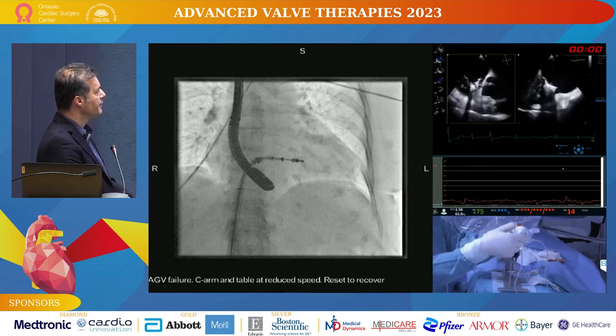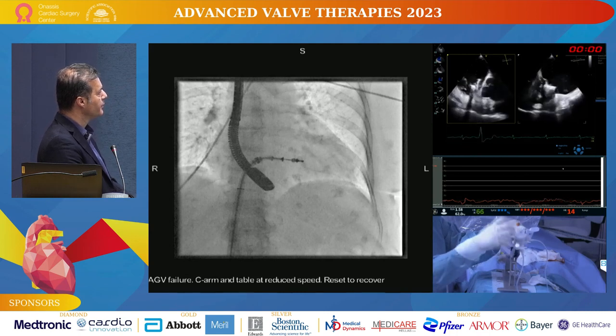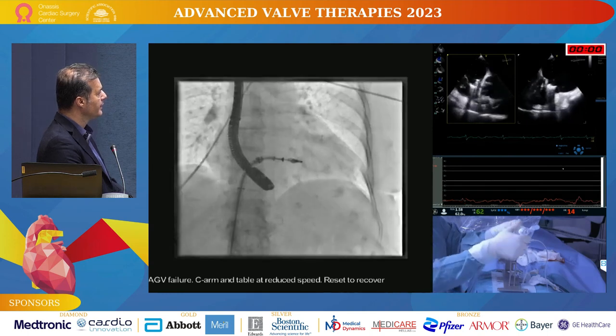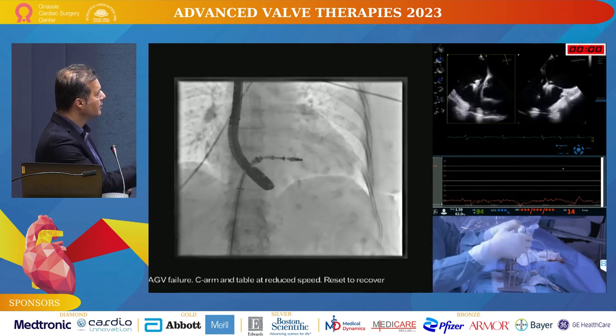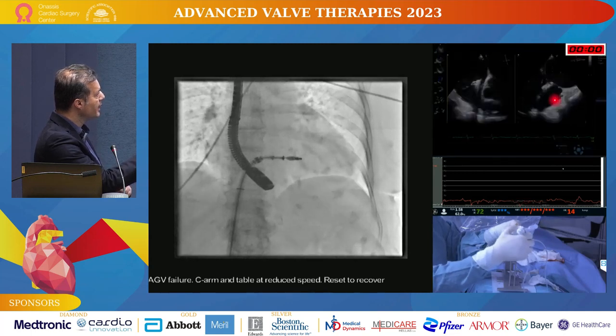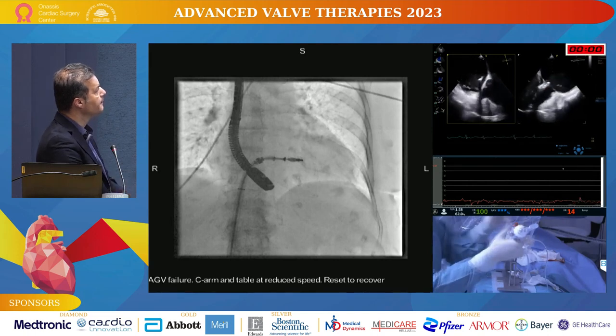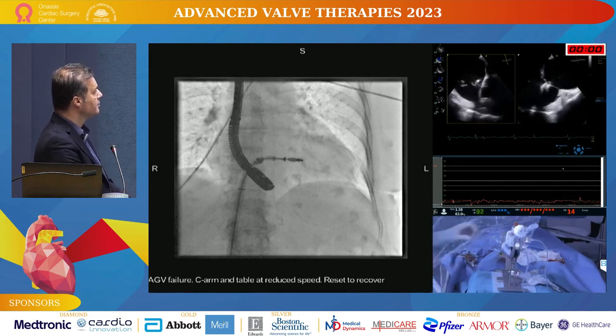Now you see the leaflets are flat. We're happy. We drop the grippers and we slowly close the arms of the clip, releasing some tension. And now you can see the clip closes. The leaflets are immobilized. We record this so that we're able to see. And that's a good grasping.